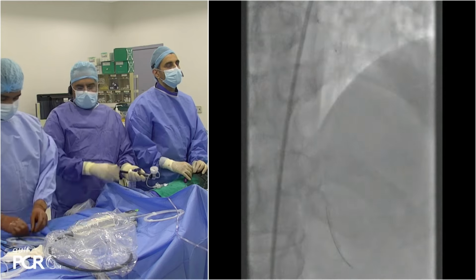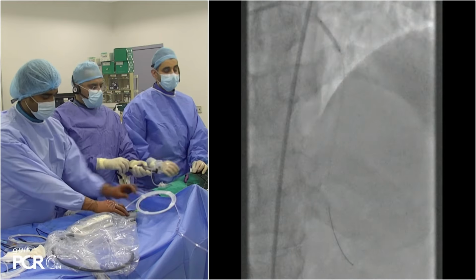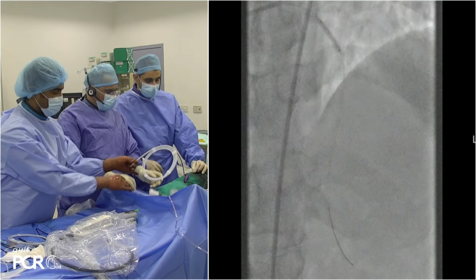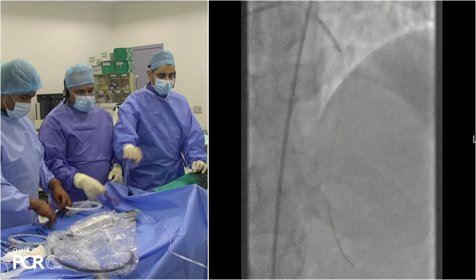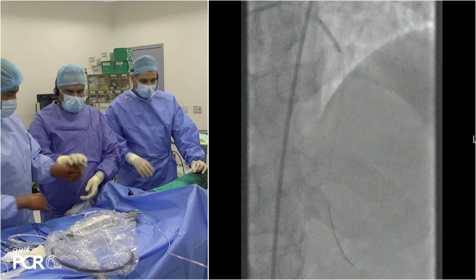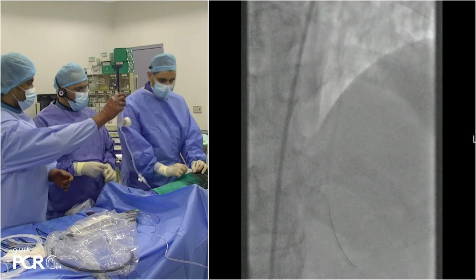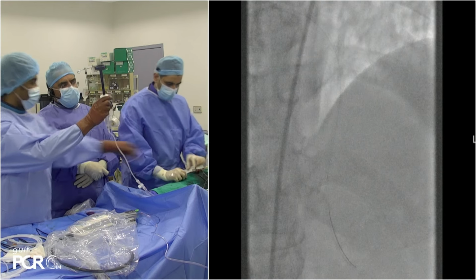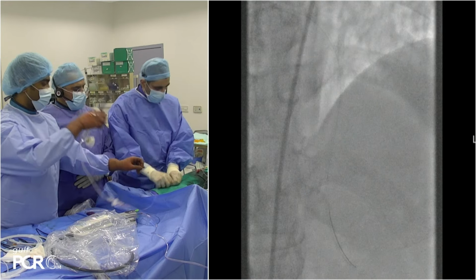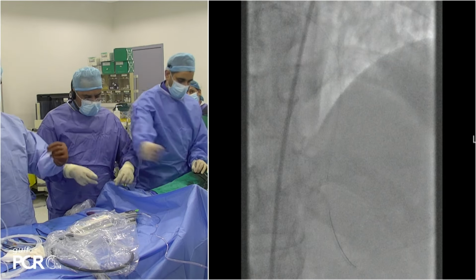Okay, let's have the OCT. So to your point, Dr. Arif, we just checked the ACT again maybe 5 minutes ago. It was 270, so we gave a little bit more heparin. We gave 2,000 more heparin. So the 2.5 balloon was opening. There is no waist. We're happy with the result. We'll do OCT next. We'll show you. Hopefully, we can show you a fractured calcium.